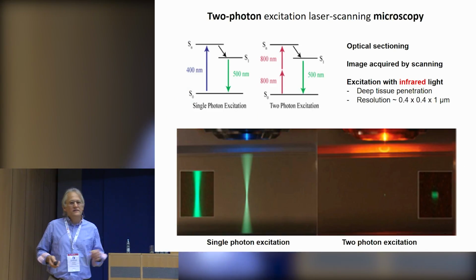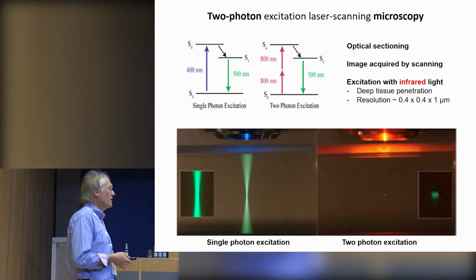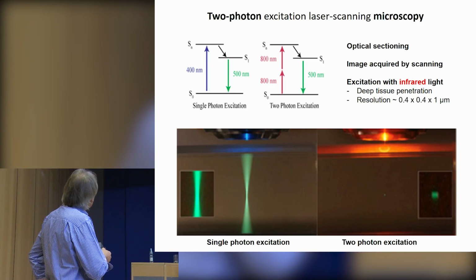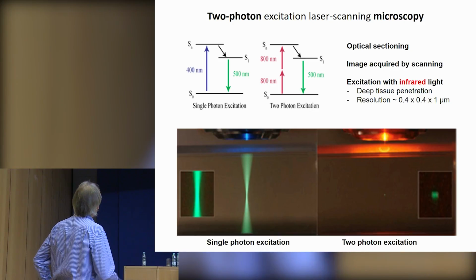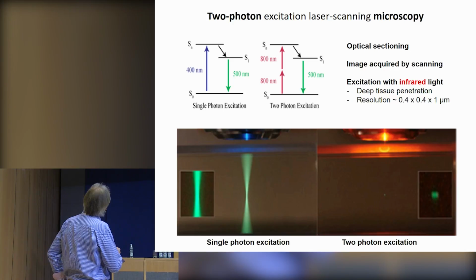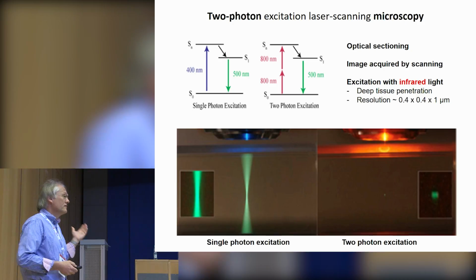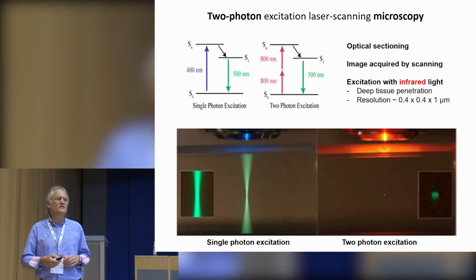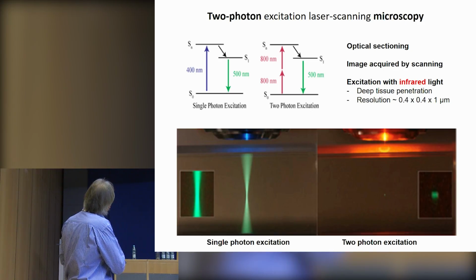And how we do that is using 2-photon microscopy. I'm sure that most of you know about this, but I'll nevertheless just point out some of the key features here. So this shows you single photon excitation with blue light as shown here. So you excite your fluorophore, emit green fluorescence, and you can see that this fluorescence is distributed in this hourglass-like shape. So you have a huge volume where you excite molecules, meaning that typically people think you get the signal from the focal plane here, but it's actually only 50% in this kind of wide field imaging approach that comes from the focal plane, the rest comes from elsewhere.